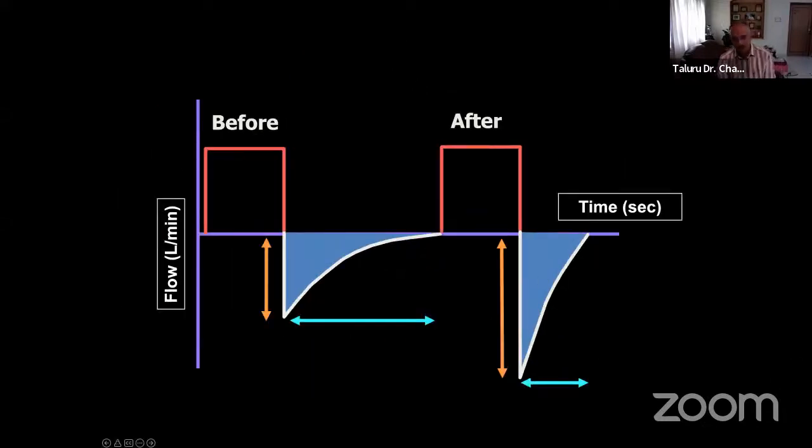See, what was the problem here? And what is the problem here? I have done something to the patient. What have I done to the patient? Type, what has decreased? What is this? And what is this time? This is the peak expiratory flow. This is the expiratory time. So the peak expiratory flow has reduced and the expiratory time has increased. But there is definitely not much of an auto-PEEP. If the patient also had auto-PEEP, what would you do to the patient?